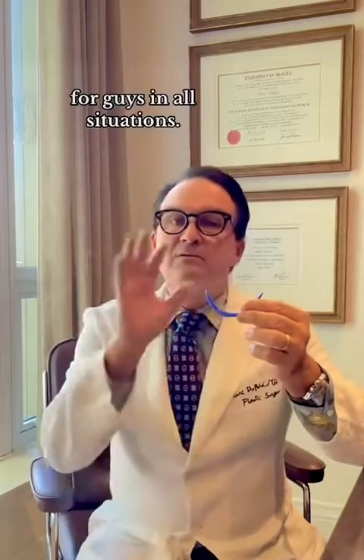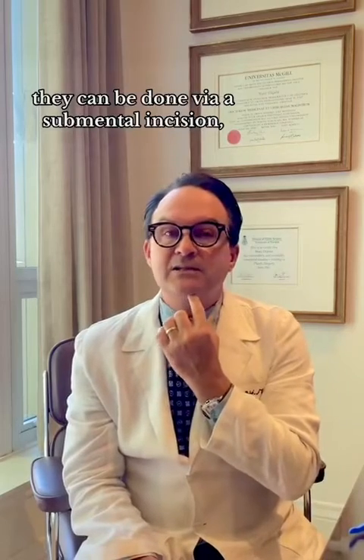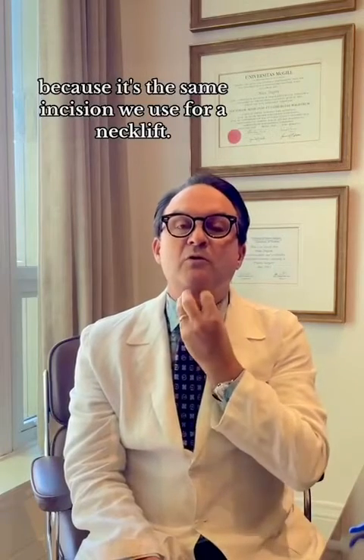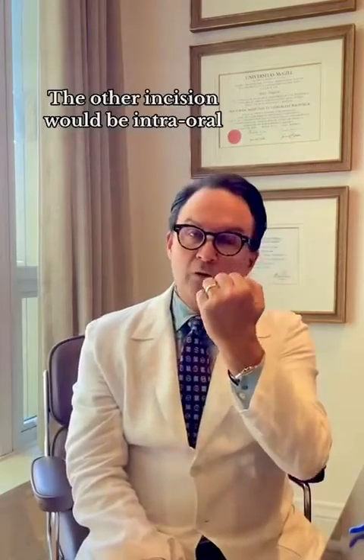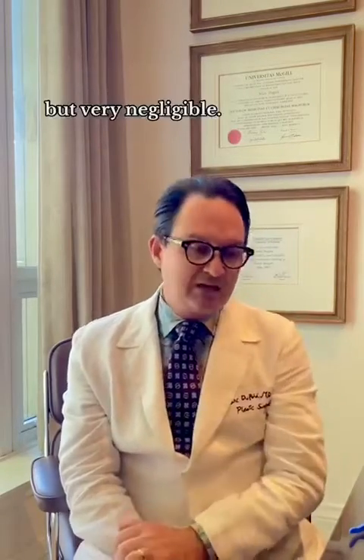In all situations, there are two ways to insert those implants. They can be done via a submental incision. It's a common incision nowadays to use because it's the same incision we use for a neck lift. The other incision would be intraoral, so we still use it periodically, where we go inside the mouth. There's a slight increased risk of infection, but very negligible.